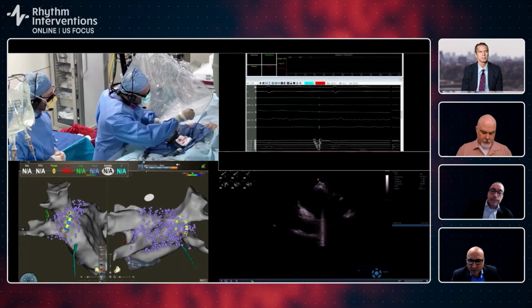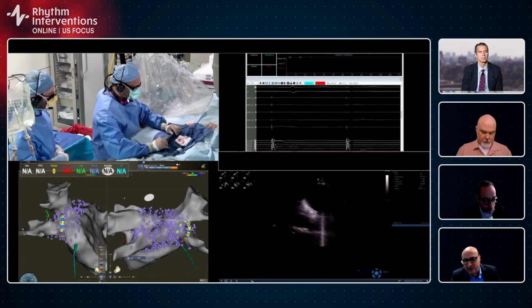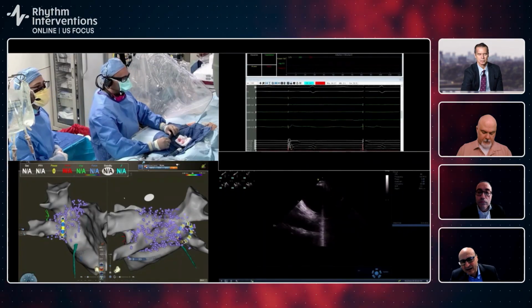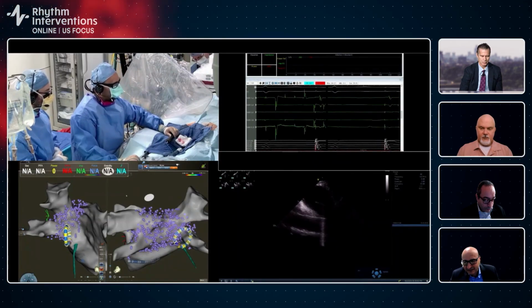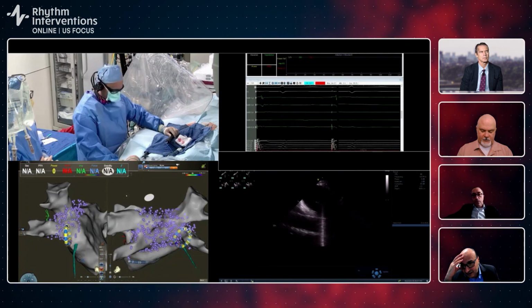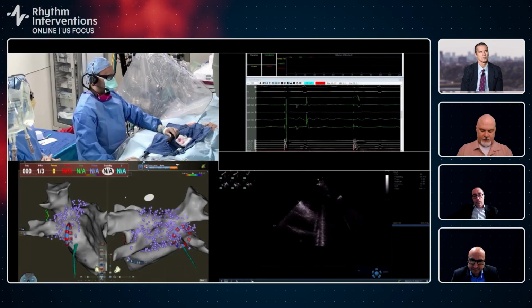You can use it for the pulmonary veins, for the posterior wall, and as a regional ablation catheter, for example the antrum of the veins. You can select electrodes. It is the same catheter used for mapping and ablation, it has a tissue proximity indicator, and it's integrated with an electroanatomical mapping system. These are all beneficial features of this catheter.